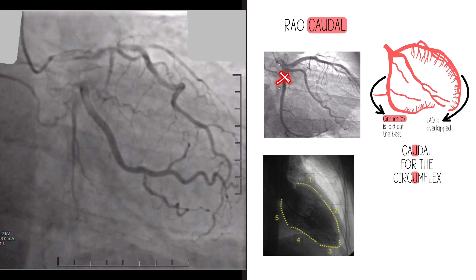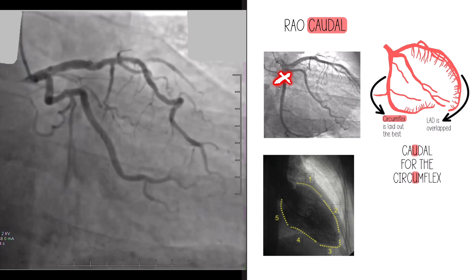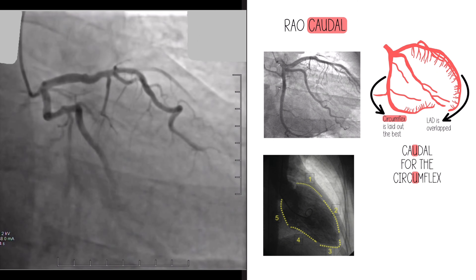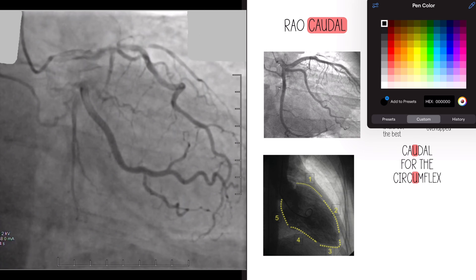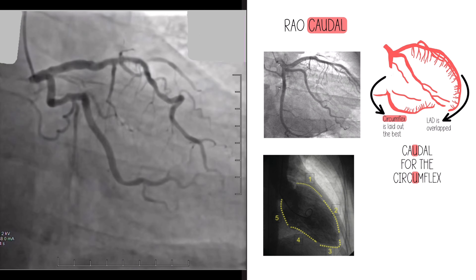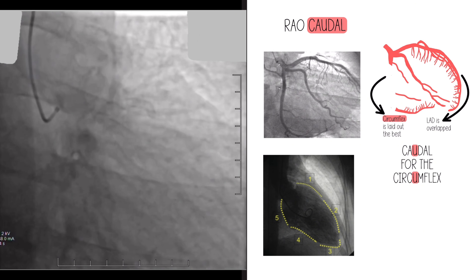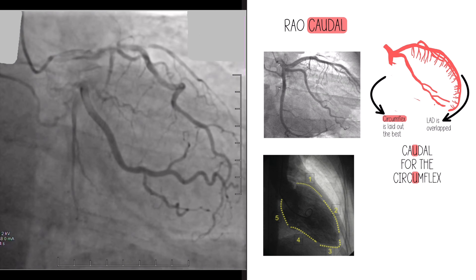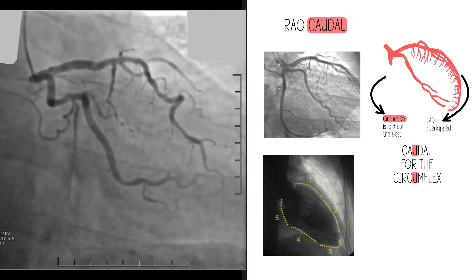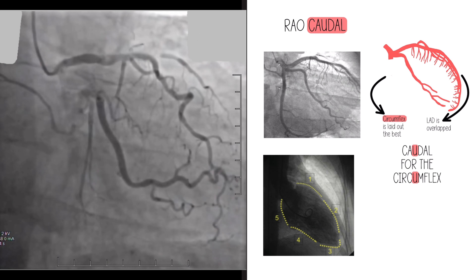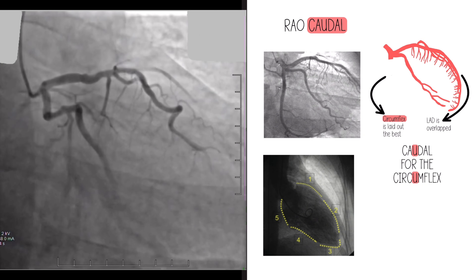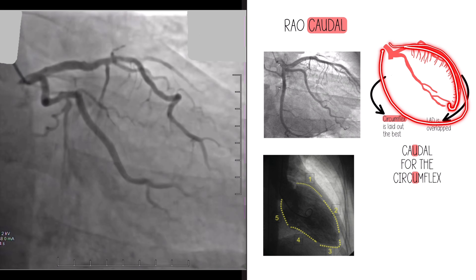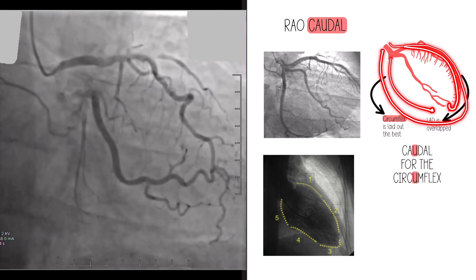It gets a little more complicated when you have things that are occluded. Even if this had a STEMI with an occluded circumflex, same idea applies. You see the heart shadow and go, this is RAO, so this is the LAD — something's missing, it must be the circumflex that's missing. The coronaries are on the epicardium and should be outlining the heart shadow for you.